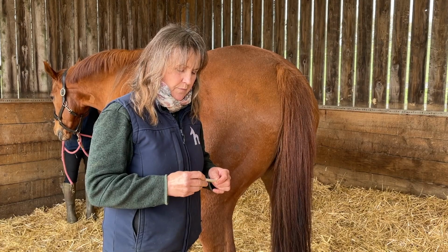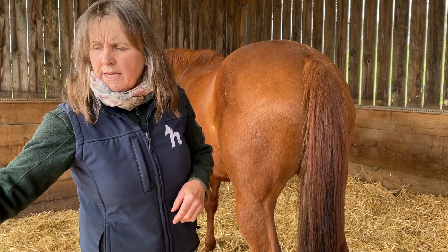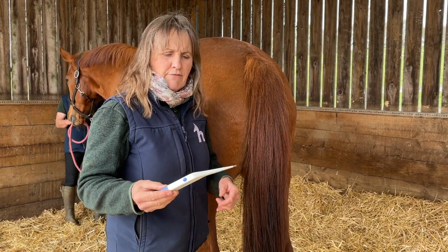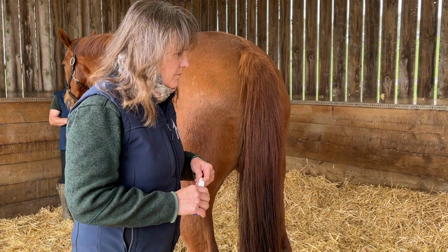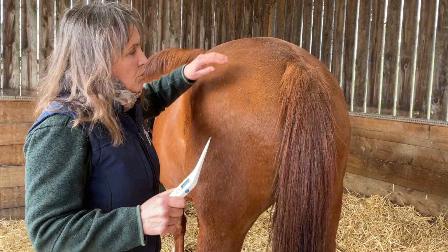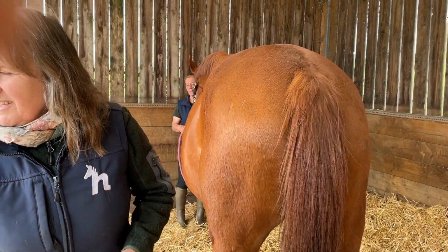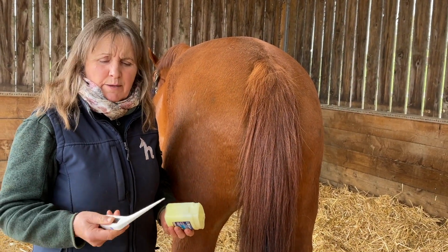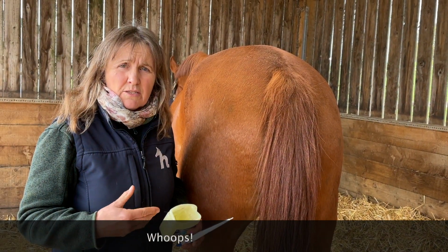It's part of technology that we've moved on, and we've got several options, but we kind of go for the big ones, mainly because they're more easily found, and there's certainly no chance at all of you losing that in a horse's rectum, unless you were being very ambitious. So, in terms of lubricant, yes, you might have your very handy pot of petroleum jelly handy. If you don't, then there's nothing like a bit of spit that will lubricate something, but it's better for the horse if you look at something that is going to lubricate.